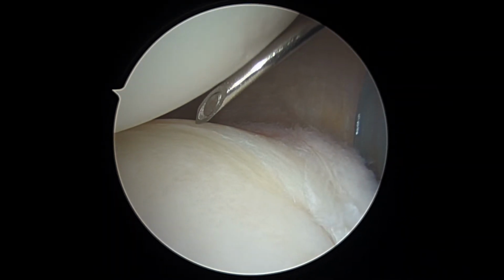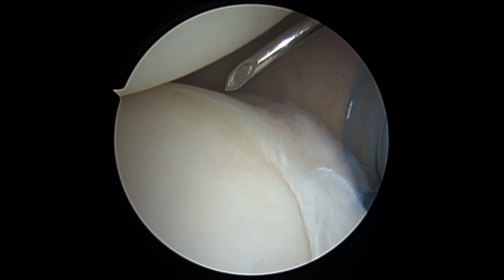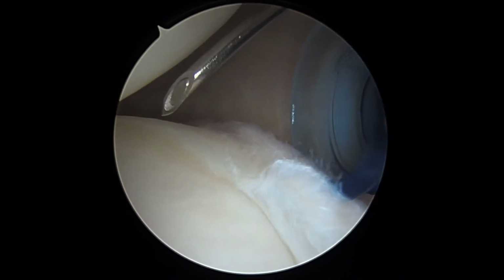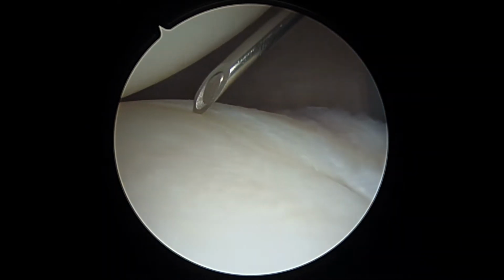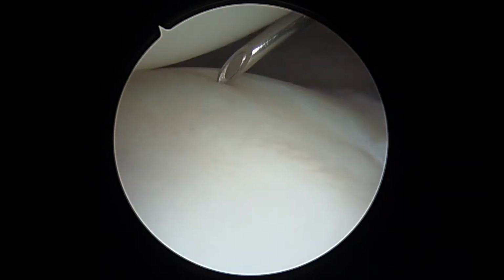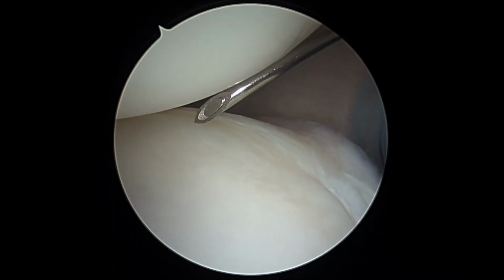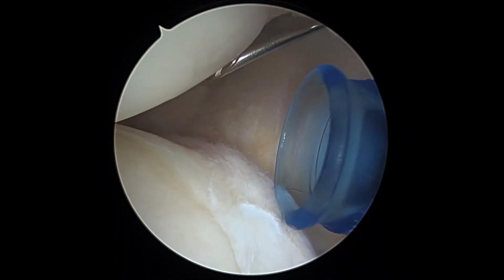We did examine your shoulder before we started, and it was quite unstable. It would dislocate both anterior and posterior. And we can see here the articular surfaces look great. You haven't really lost any bone on the glenoid below or the humeral head up above. So this is very much what your left shoulder looked like back in June. And so now with this spinal needle, we're just checking our angle of insertion. Sometimes we use a curved inserter here, sometimes just straight. It looks like we can try and go with our straight inserter here for you.